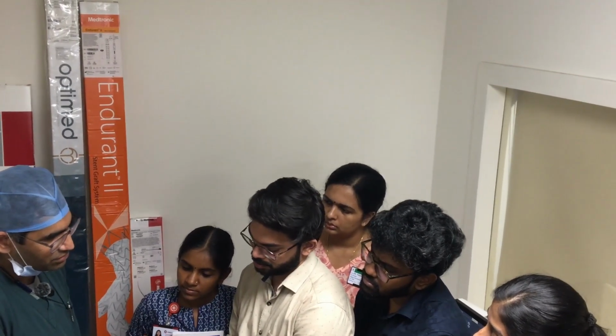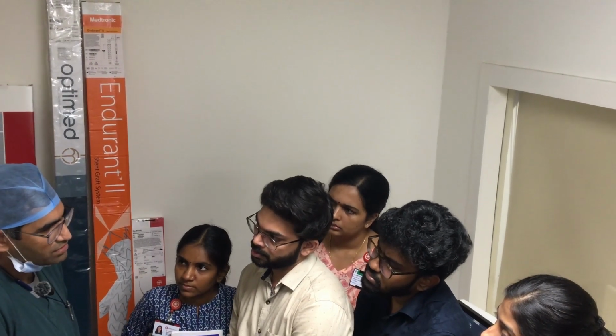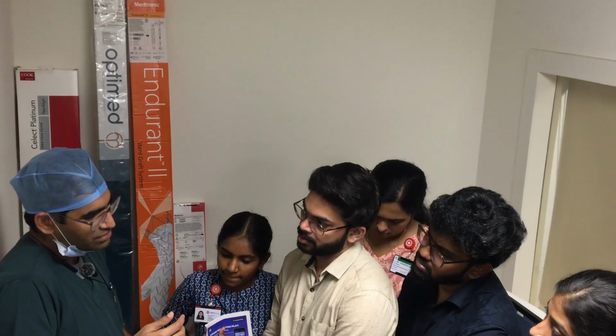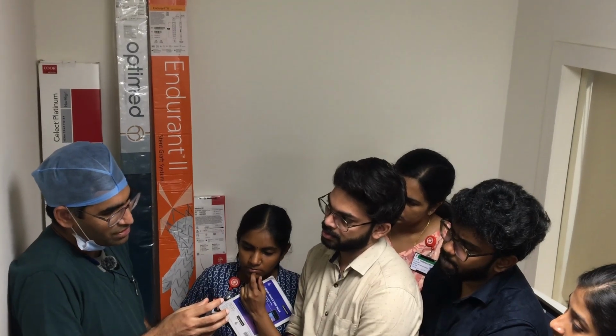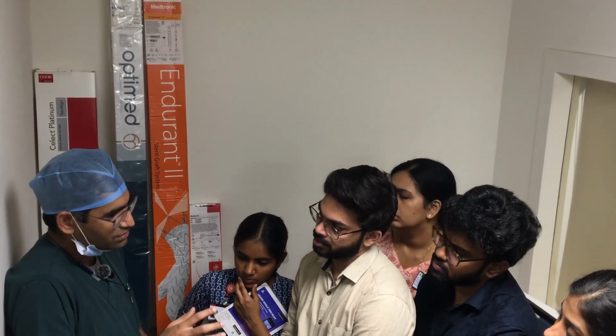The CTO wires come in a lot of tip loads. Tip load is basically, there is no actual load at the tip. By literal meaning, it would mean that something is kept over the tip which is increasing the load. It's not like that.